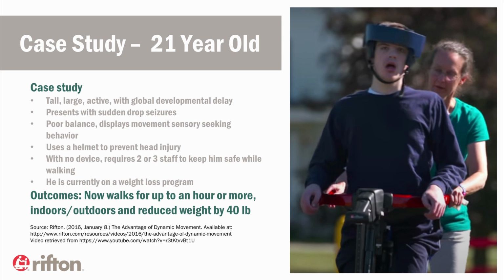The benefit of the gait trainer for him is that he's comfortable, safe, and can walk with the supervision of 1 adult. And the dynamic movement of the frame gives him a great freedom of movement. He has tolerated walking for up to an hour at a time, and this has benefited his weight loss program as well. So we will watch a short video clip showing his success with the pacer.